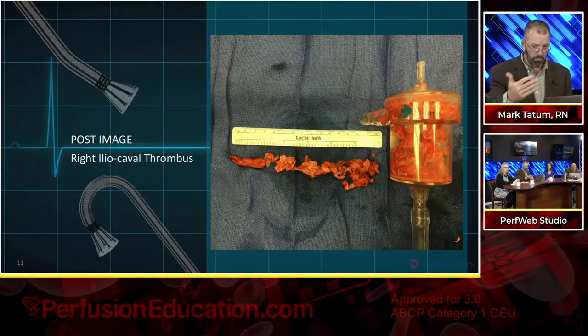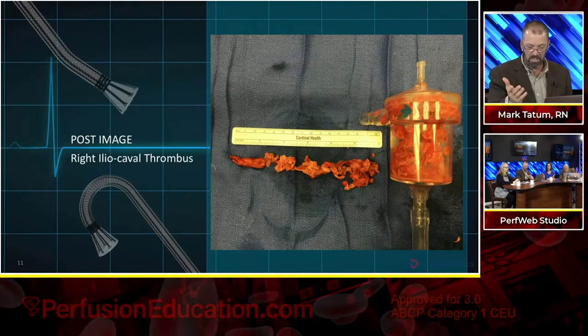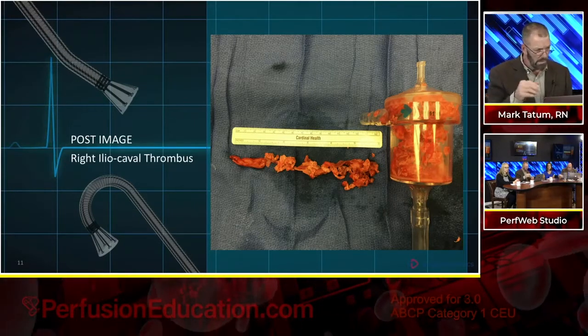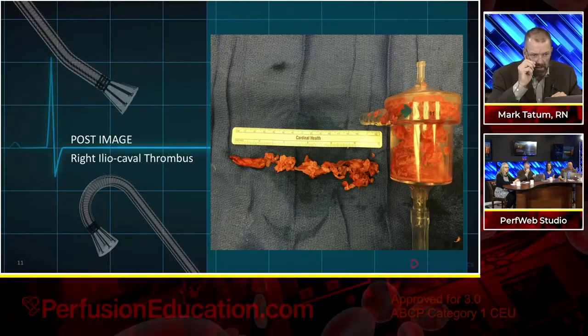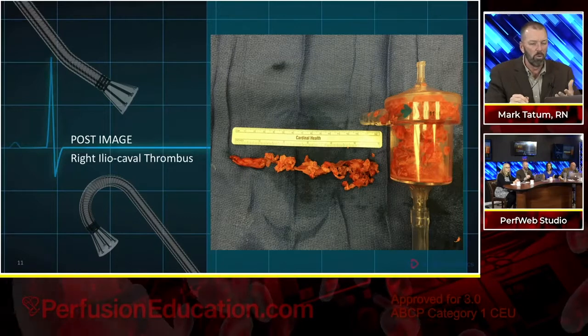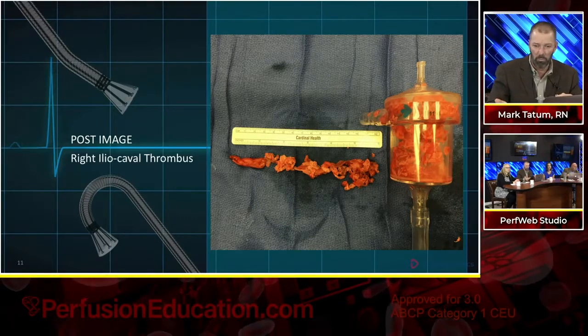But this is clearly not fresh or soft. There is a significant amount of chronic thrombus that's sitting in this space. Because our goal is to find and treat fresh or soft thrombi or emboli, we can do that. But some of the imaging modalities are not really going to tell us whether what we have is fresh or has a chronic component to it.